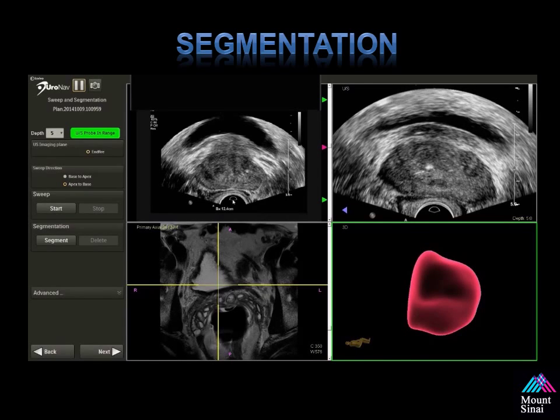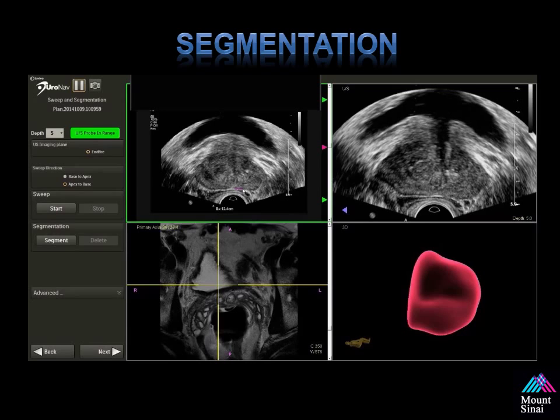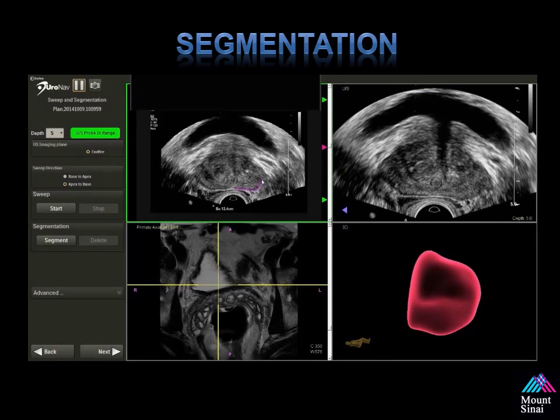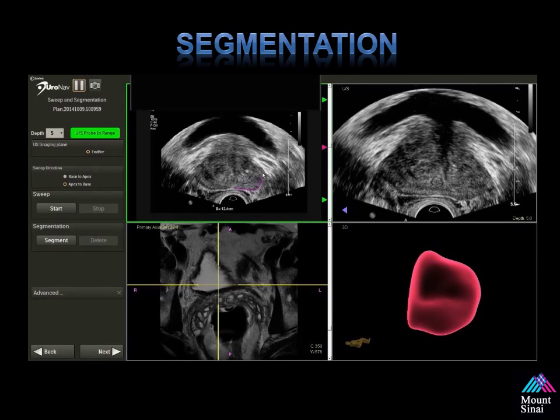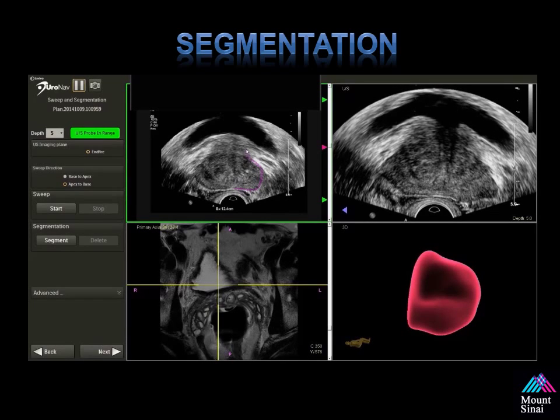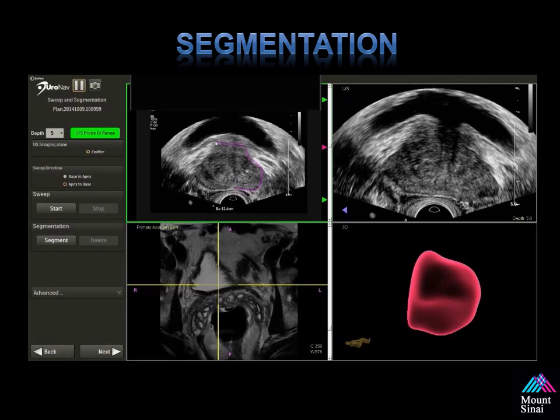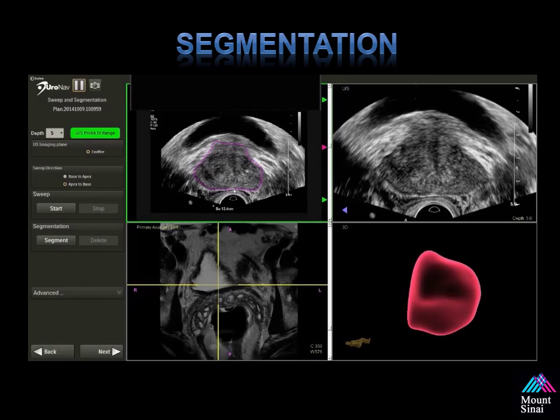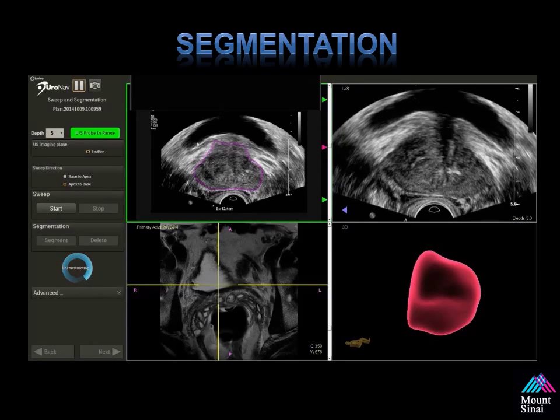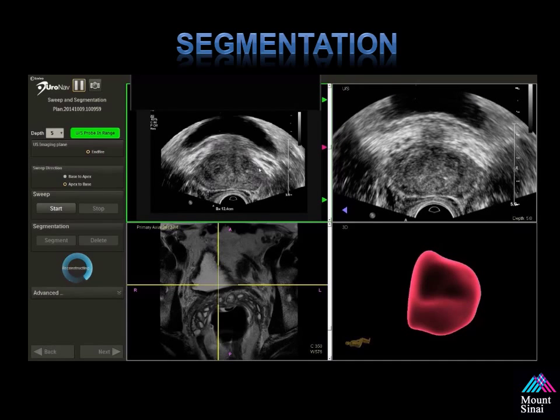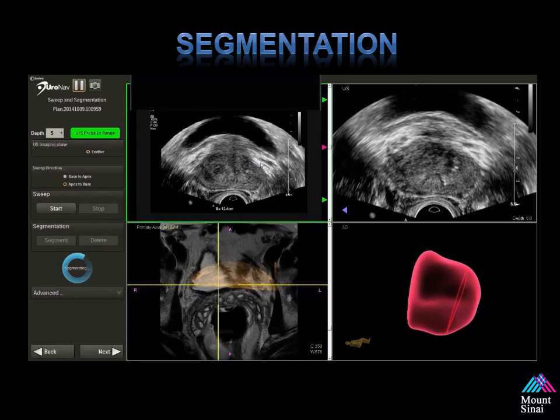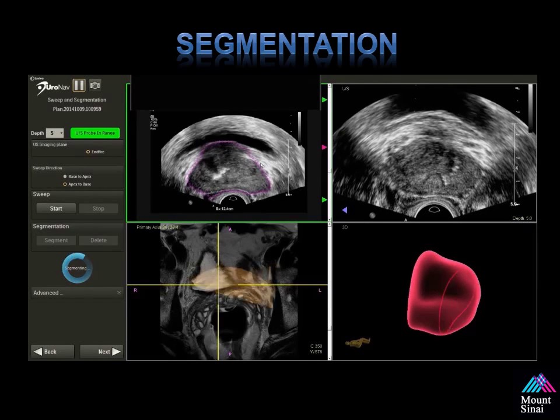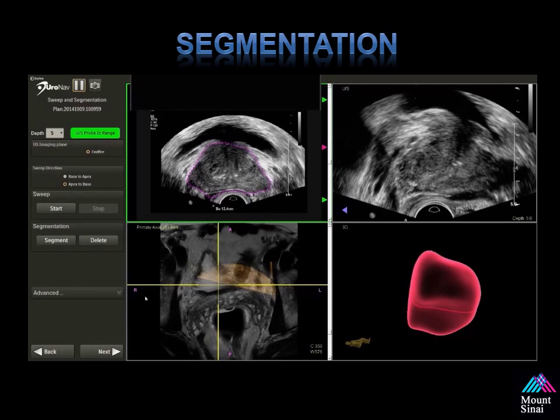Now we'll segment the prostate by outlining one slice. You don't always have to do this, but for teaching purposes I am not skipping any steps to allow you to understand how the technology works. Typically my ultrasound technologist performs this while I'm holding the probe inside the patient. It's always important to make sure your ultrasound depths are set the same on both sides of the screen. We're reconstructing and segmenting the prostate in real time. Once completed, we confirm good ultrasound segmentation — notice how the purple dots outline the entire prostate.